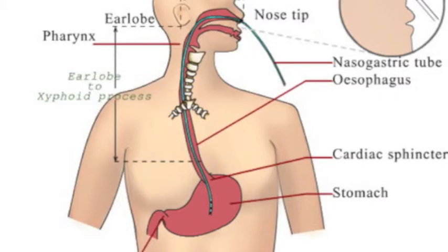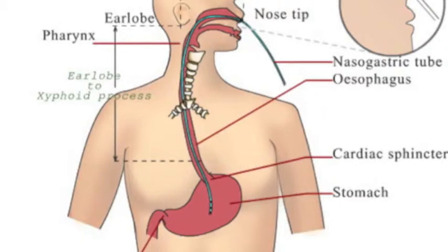And a duo tube. A duo tube I don't have here to show you, but a duo tube goes further than the stomach. It's the same principle as a Levine, just a straight tube, but it has a little bulb on the end. I don't know if your book has a picture of it. You displace that tube with air once you get to a certain area, you displace it down into the stomach, past the stomach to the duodenum. That's a duo tube.